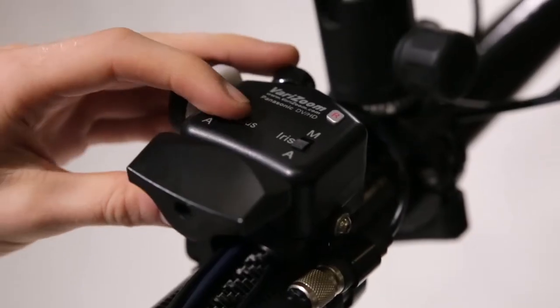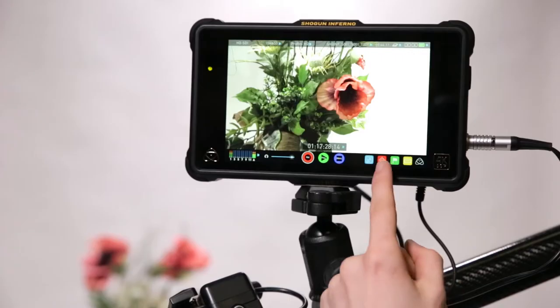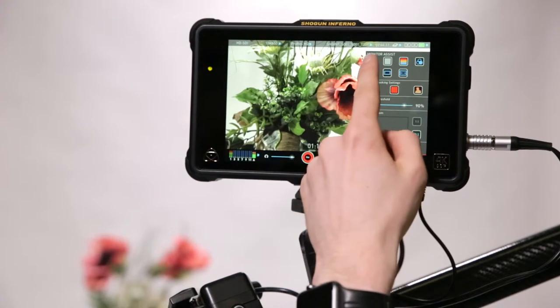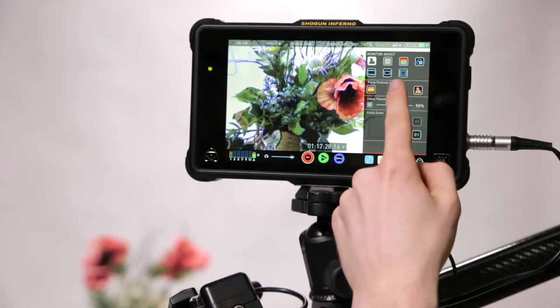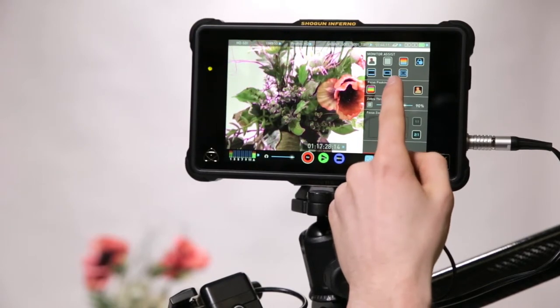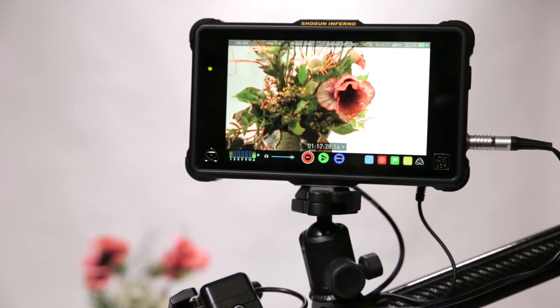We strongly recommend shooting in manual zoom and focus as this will allow full control over the picture. We also recommend the use of the focus assist on the monitor. You can do this by pressing the red target button and enabling the focus assist. Set the peaking to an appropriate colour so that your focus point can be clearly seen.